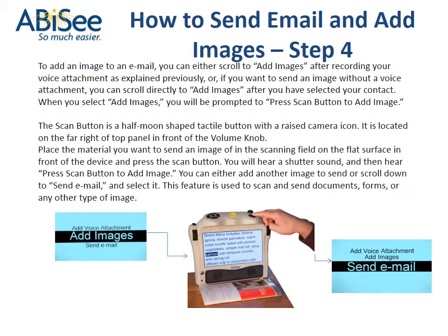When you select Add Images, you will be prompted to press Scan button to add image. The Scan button is a half-moon-shaped tactile button with a raised camera icon. It is located on the far right of top panel in front of the volume knob.